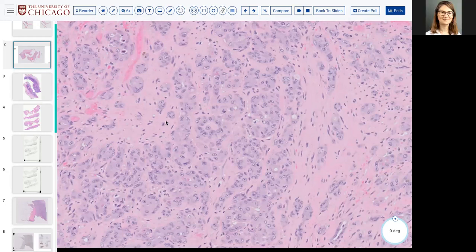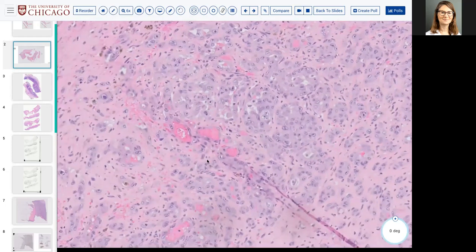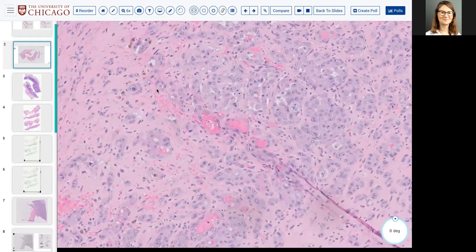Exactly. If you ever have a small biopsy with what you think is a vasoformative vascular lesion, you've proved it's vascular with your four markers up there. The other marker you might want to add on, as Riham said, is an SMA. An SMA in a hemangioma would generally show you a positive pericyte layer around these vascular spaces, whereas it generally would not in an angiosarcoma. Other than mitoses, necrosis, and cytologic atypia, that can also be an additional factor that comes into play for these.